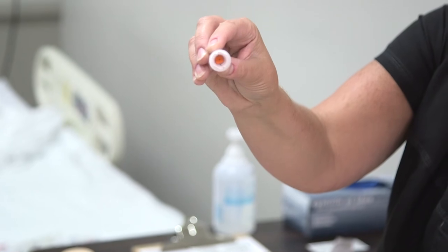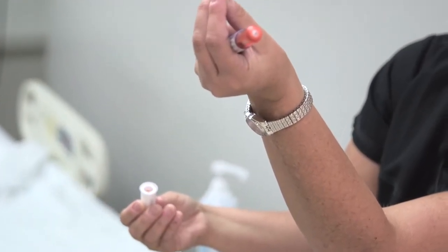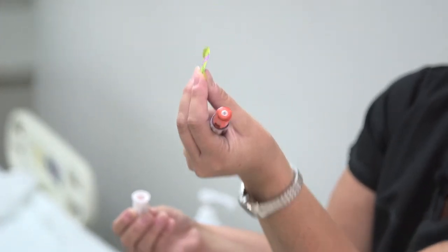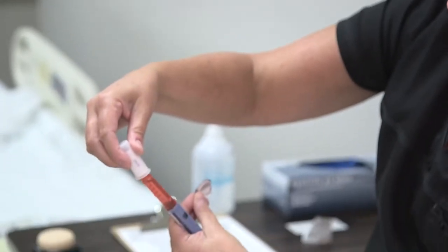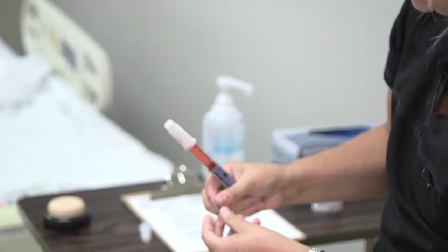When you open up the needle, you'll see a little sharp inside — that is going to puncture the rubber stopper on the pen. Go ahead and put the needle on, push it in, and turn to tighten. Now you know the needle is attached.